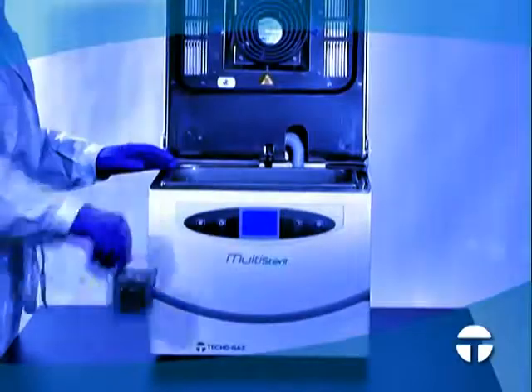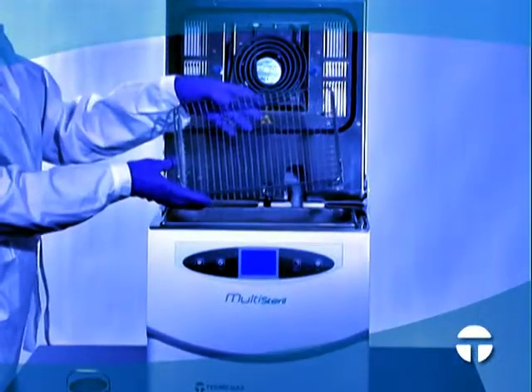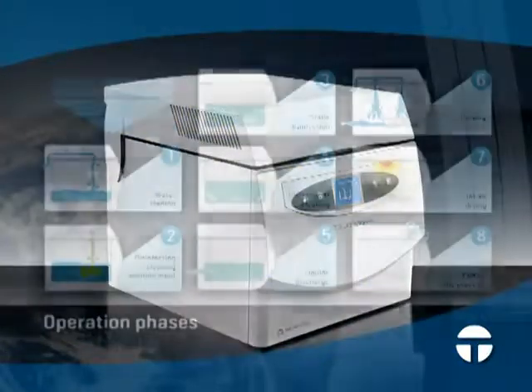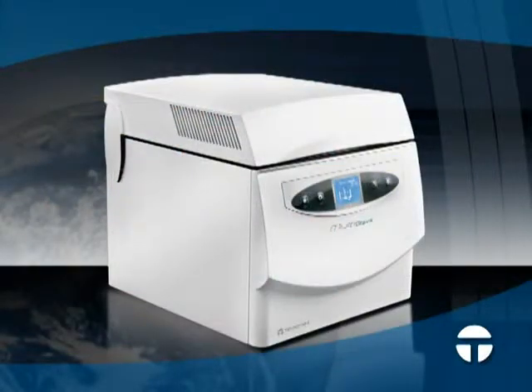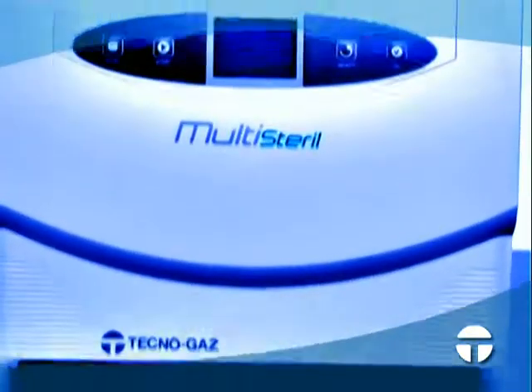Multisteril is a truly innovative invention that is changing the procedure required for sterilization. A remarkable appliance that makes your work much easier and safer, while guaranteeing you a significant saving in costs. Only a company leader in the sterilization world could have conceived such an advanced appliance, able to meet the demands of the market.